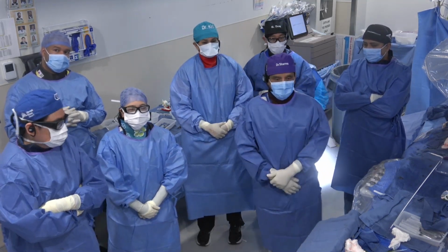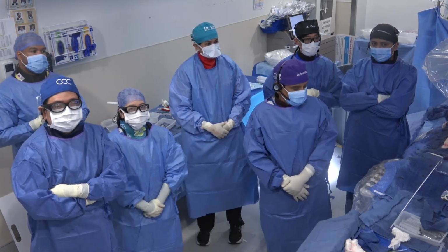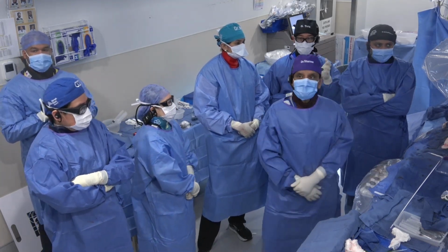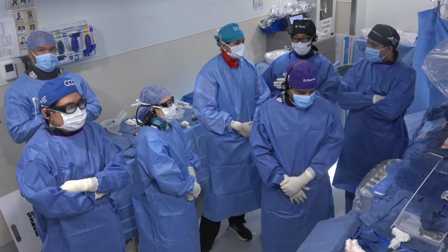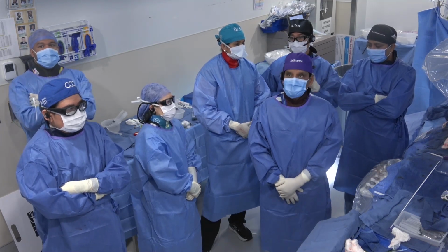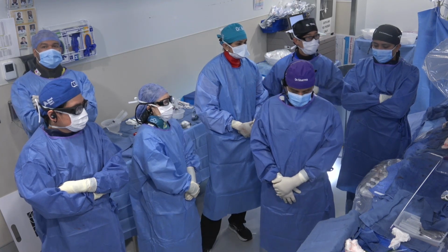We've done TAV in TAV live cases now. You can look up our ccclivecases.org website to look at our past cases. The SAPIEN, when you put it in either an Evolut or SAPIEN, can foreshorten from the top a little bit as well. So just be careful. That's why Dr. Kini showed a very nice technique of really slow inflation, and you have to tell your anesthesiologist it's going to be a long pacing run, so they don't get distracted, and prepare to intervene if we need to.